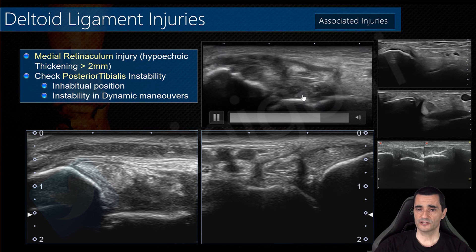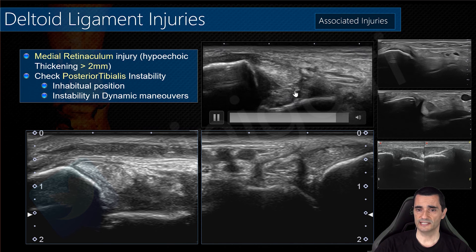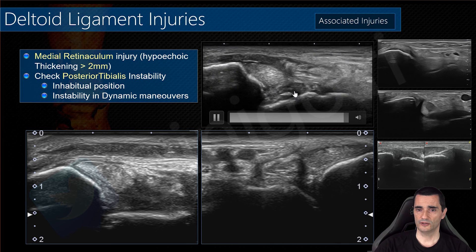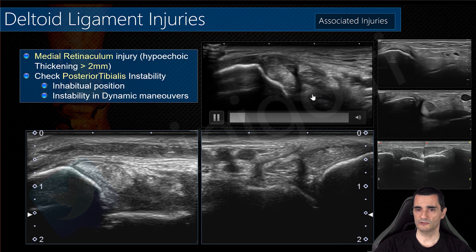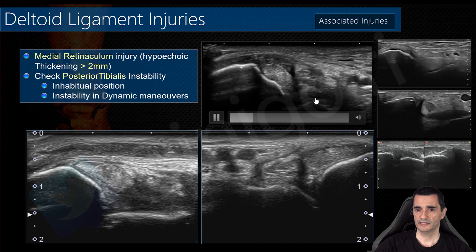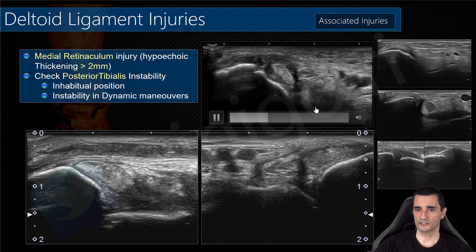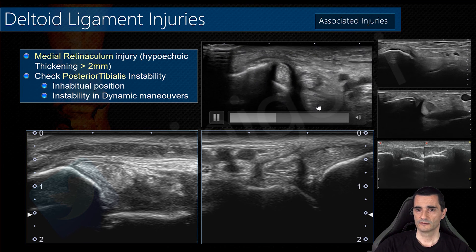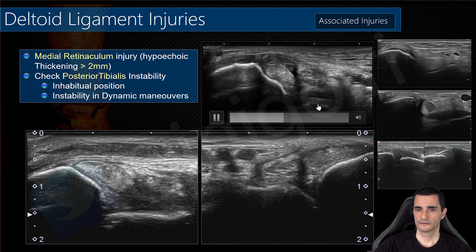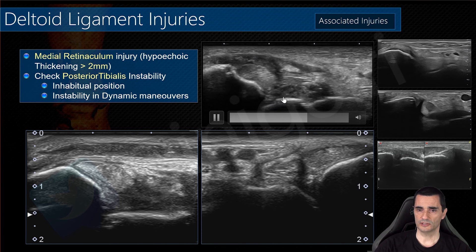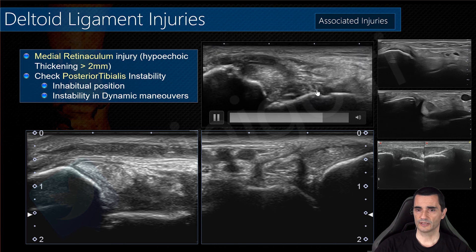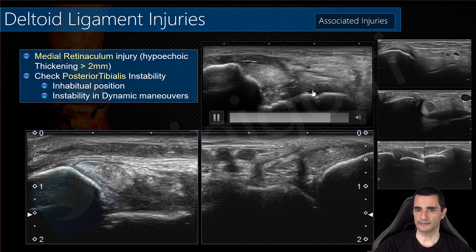This image shows an affection of the deltoid ligament with what appears to be a complete rupture of the deep component of the posterior tibiotalar ligament — but this image is shown here to illustrate the retinaculum affection specifically.